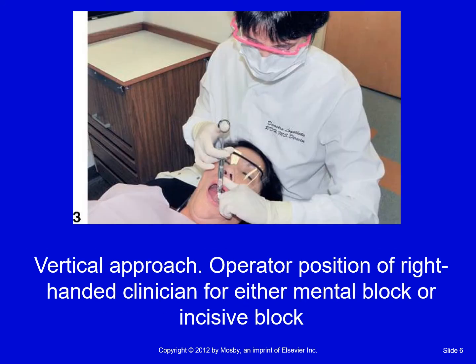There are two approaches to giving this injection for the operator. You can position yourself at a 12 o'clock right behind, and you can see to where she's able to go ahead and just put the syringe straight down, and you can be almost parallel with the long axis of the teeth and go right in.